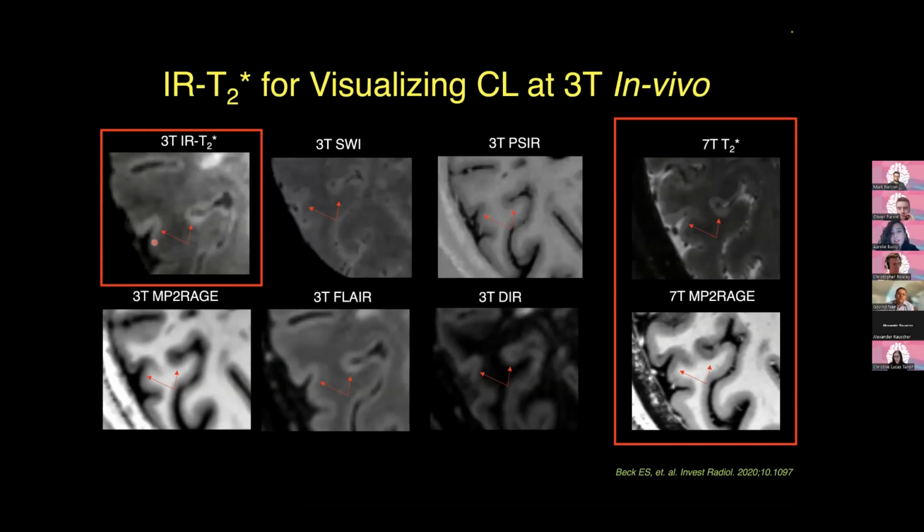I think that's a great question. The cortical lesions do change the cortex, and ultimately there is neurodegeneration, so there is thinning. But the thinning that we expect is sub-millimeter, right? These lesions appear at various places, so it's not like they always appear in the visual cortex. So you can do a group average study, but this is the problem: these lesions inconsistently appear in various parts of the brain. So we really need a high resolution technique to look for thickness changes. Even if it changes by 10%, which is about 0.3 mm, it is very difficult to do that.